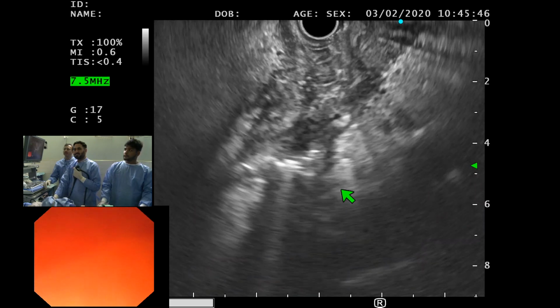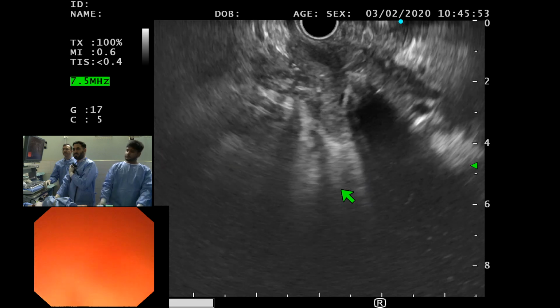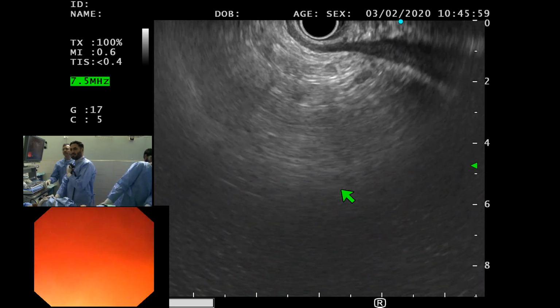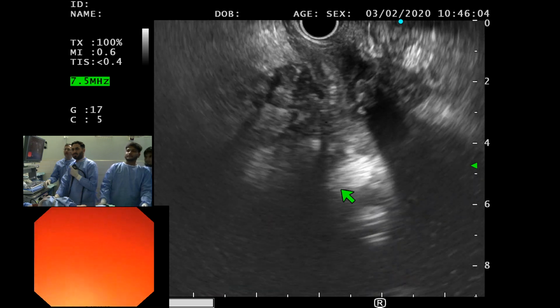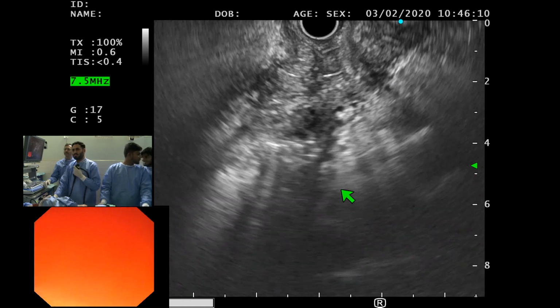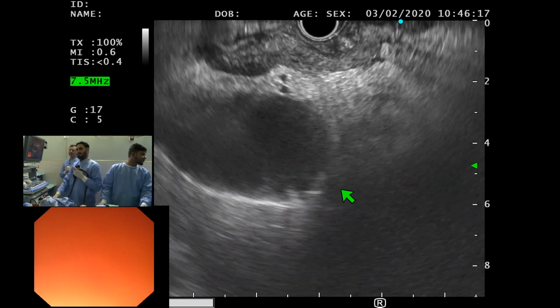Mixed echogenicity structures. And in this, you are not able to find anything recognizable, to be honest. So all you can say is that plenty of changes of post-pancreatitis are visible. There's no clear-cut accumulation of fluid which is well defined. But do you think that these are anatomical structures? Can you link them to any particular structure, any particular thing?